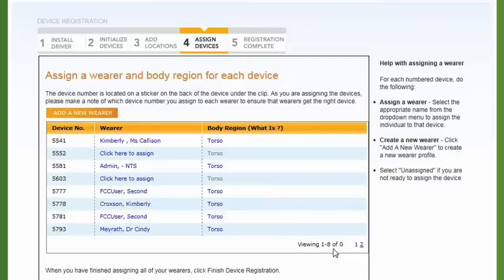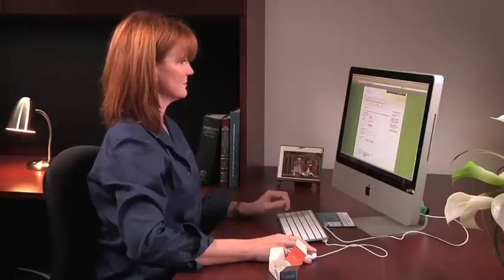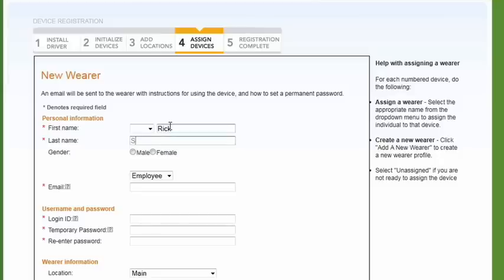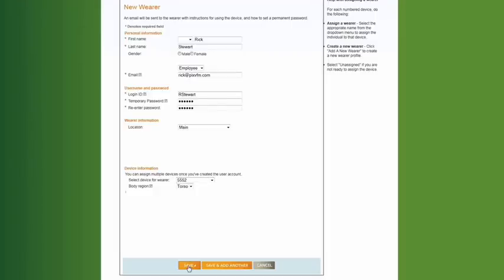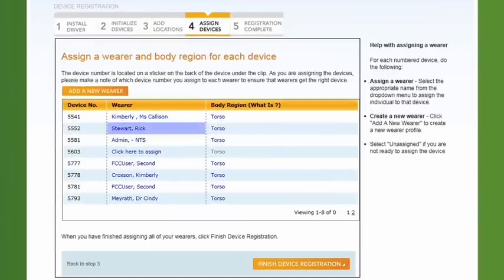This step allows you to either assign a device to yourself or to others. To assign a device to yourself, from the Wearer column, select Click Here to Assign and choose your name from the list. To assign a device to other wearers in your account, click Add a new wearer. Fill in the information required and click Save. The table will refresh with the new wearer listed next to the device assigned.